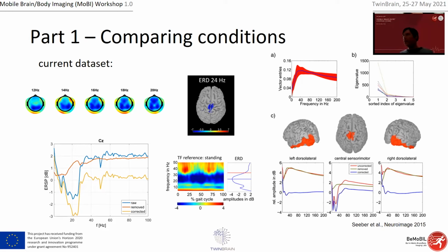I don't have direct questions in the Zoom chat nor the Discord channel, but one quick question from me. The order that you showed here was clearly ICA, remove IC components, and then do your frequency decomposition. What would happen if you did that before ICA?